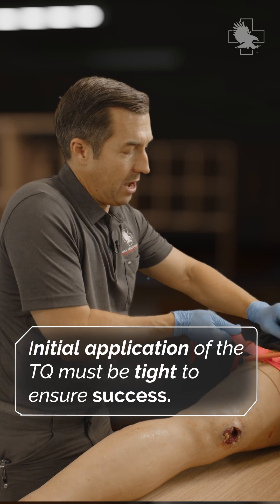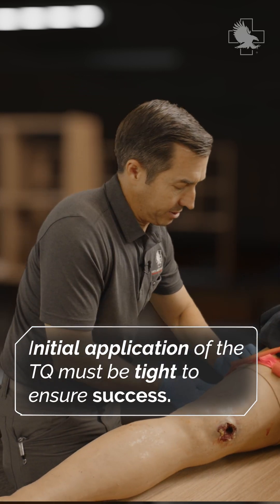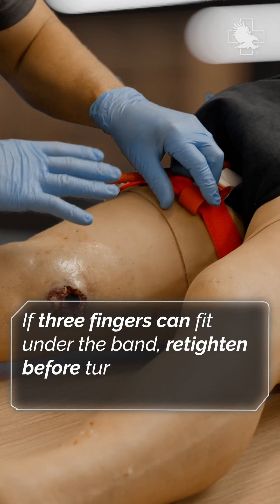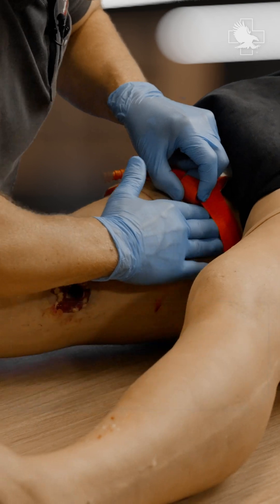This position is going to allow me to pull away from my casualty, get it nice and snug. What I'm going to do is check to make sure I've got it tight enough. So I'm going to take three fingers and try to get underneath the tourniquet.